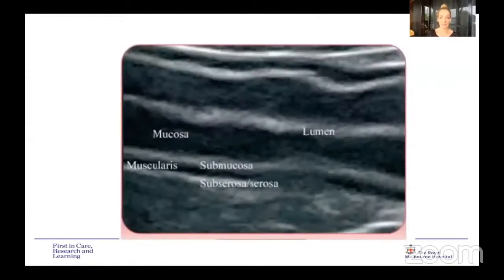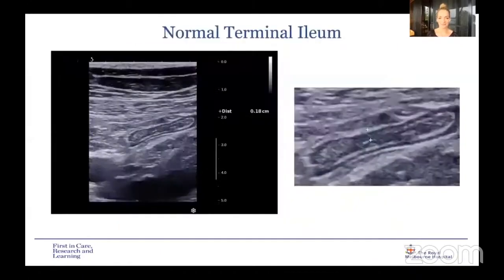That's just a close-up of exactly the same thing. As you can see, once you get your eye in, the bowel really does stick out for you. Most sonographers are trained not to see the bowel at all and to try and ignore it. But for us, this is what we're looking for, and then you can get in close-up and measure that bowel wall thickness.